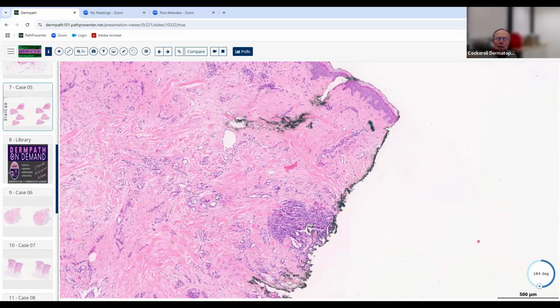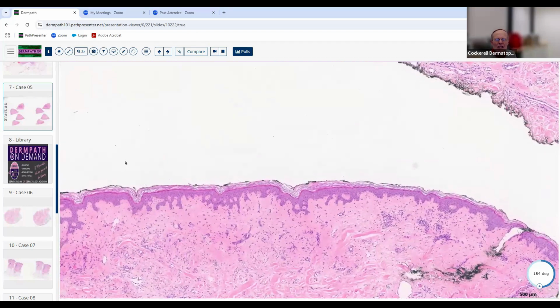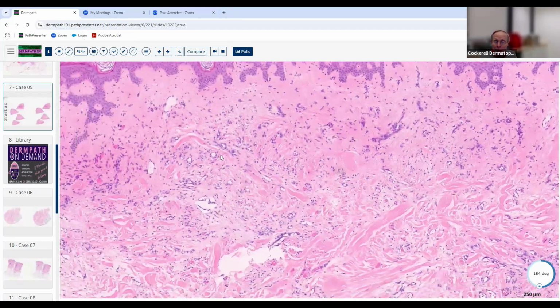You see them clinically, and they have areas of telangiectasia with an ulceration that might have almost like a little whitish discoloration, kind of reminds you clinically of atrophie blanche a little. And then you biopsy it, and it shows this almost prominent proliferation of blood vessels, sometimes with these little tuft-like structures that we see here, but mostly it looks like stasis dermatitis or acroangiodermatitis, more like this type of change, although it's on the breast.